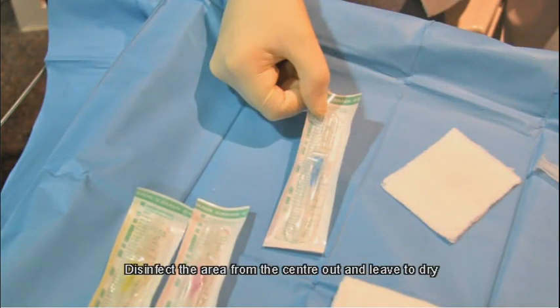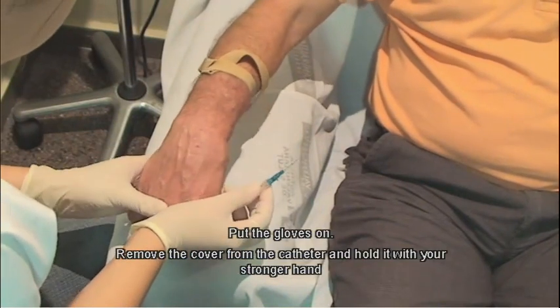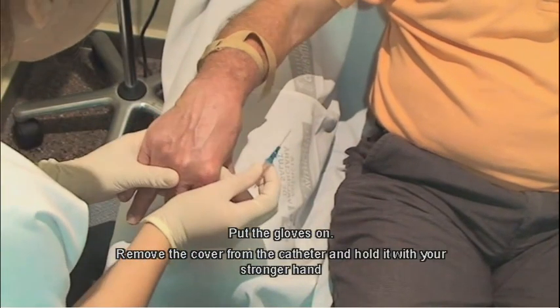Disinfect the area from the centre out and leave to dry. Put the gloves on, remove the cover from the catheter and hold it with your stronger hand.